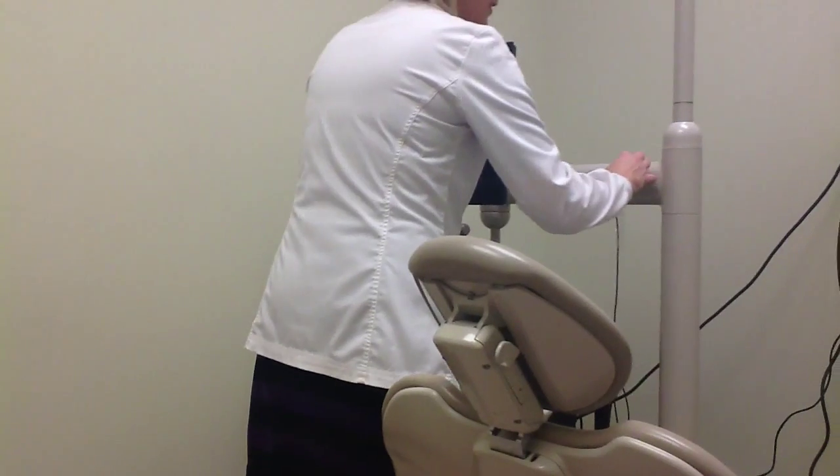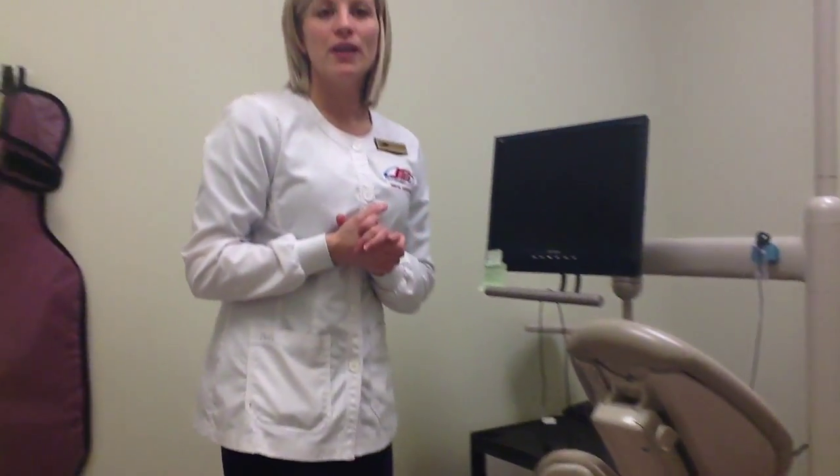And now let's talk about technique. Here at SAIT, we are using traditional, PSP, and direct digital sensor methods. When it comes to technique, we use the same technique for all methods. We'll be using the paralleling technique mostly, but you can use the bisecting technique if necessary. And that is everything — thanks very much.